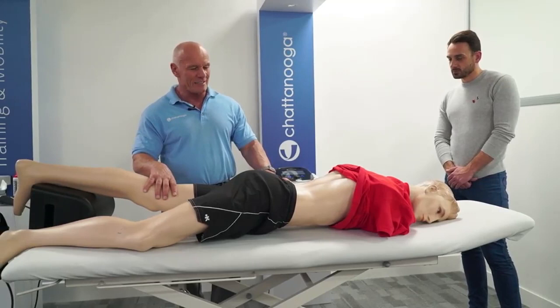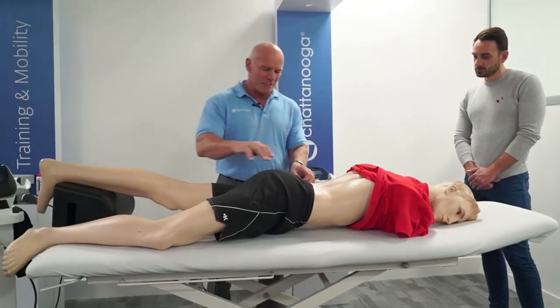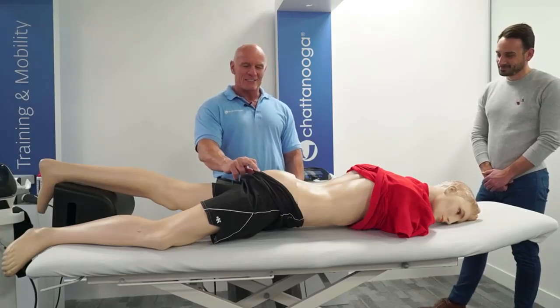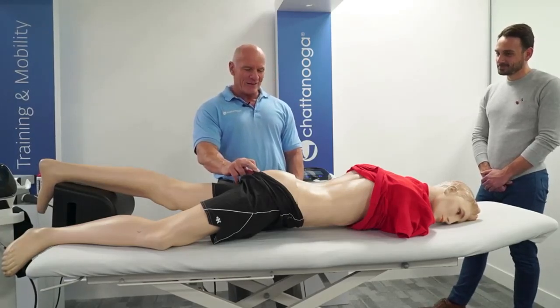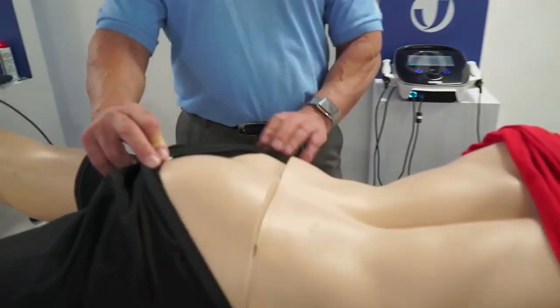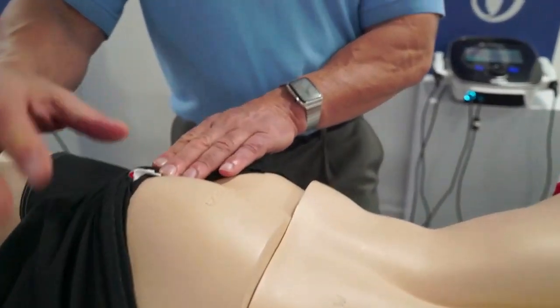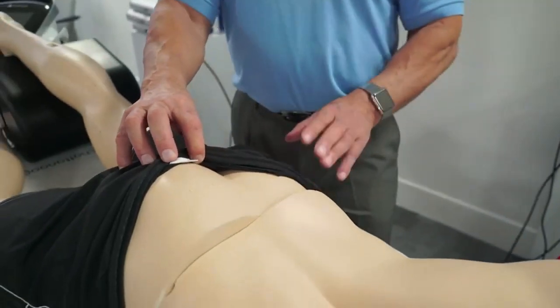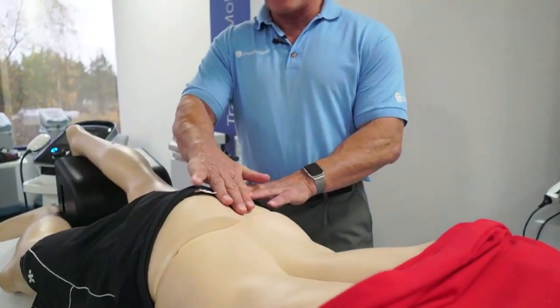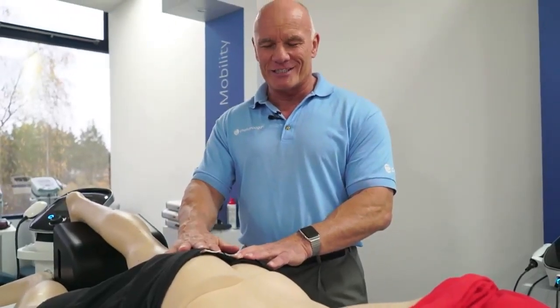And Fred, we've discovered, if you look here, oh dear, he's suffering with a very nasty case of sacral torsion here. So we've got an anteriorly rotated ilium and quite a torsion on his sacrum.